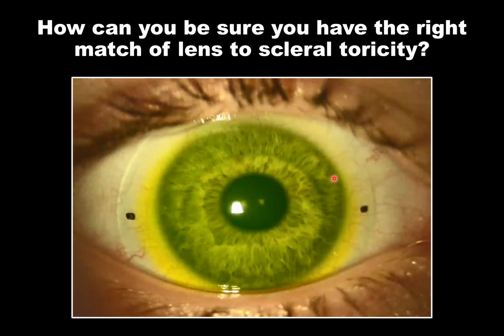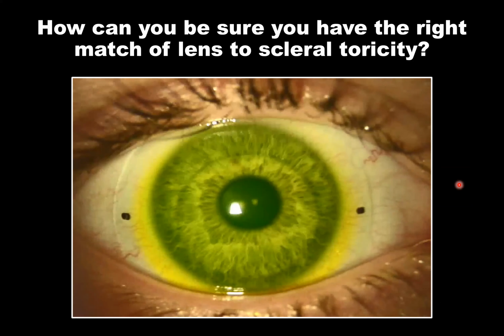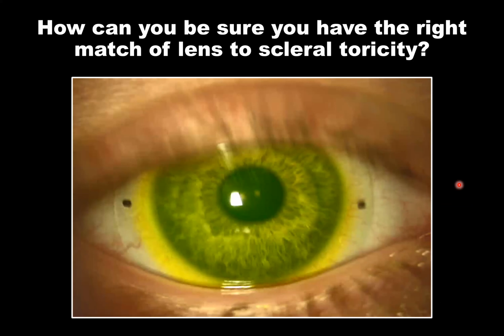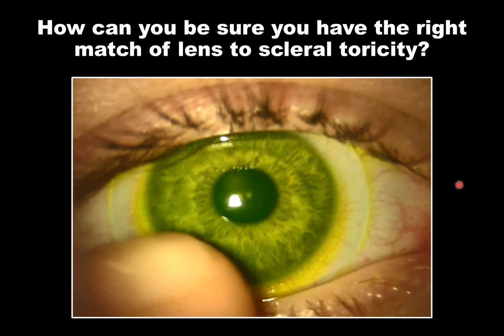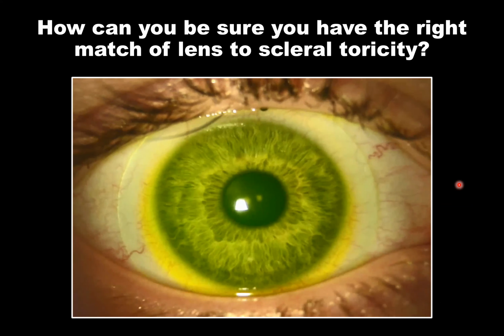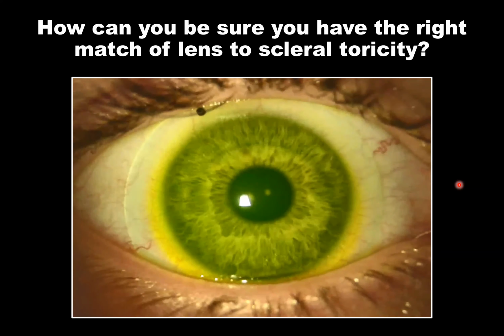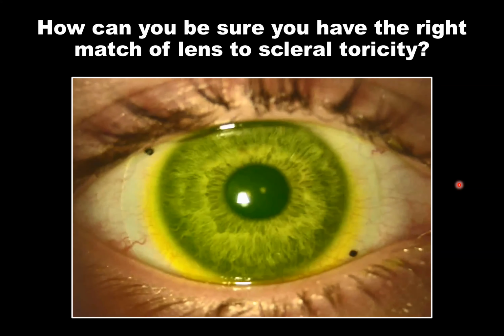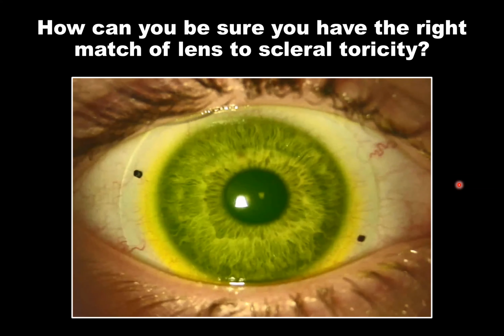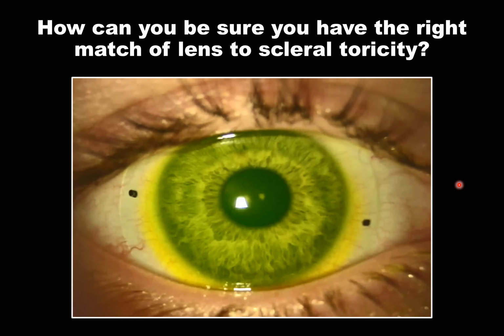Now, this toricity becomes valuable for a number of reasons. First, you can see how well it may align to the toricity of the scleral surface. If we take this diagnostic lens and rotate it 90 degrees off axis, let's see what happens with that lens to surface relationship. Notice the diagnostic lens wants to return back to that same point that we began with.